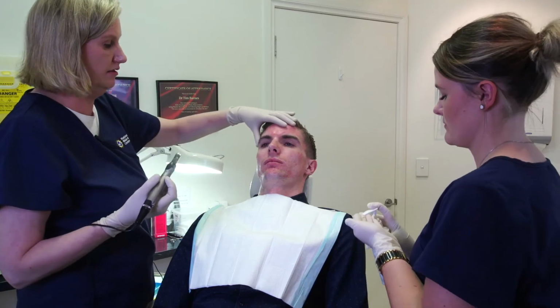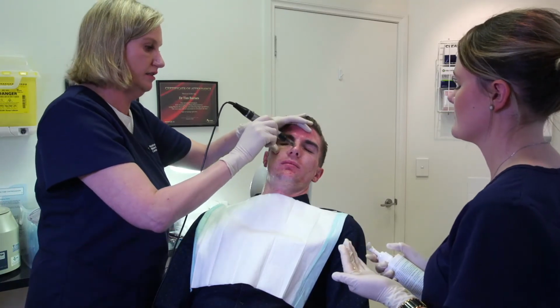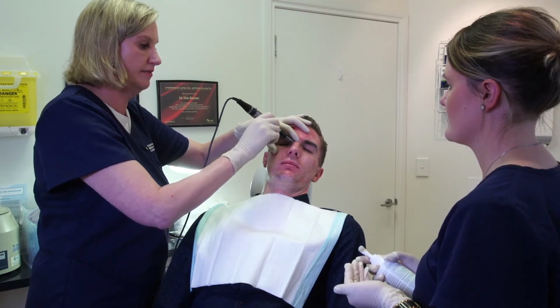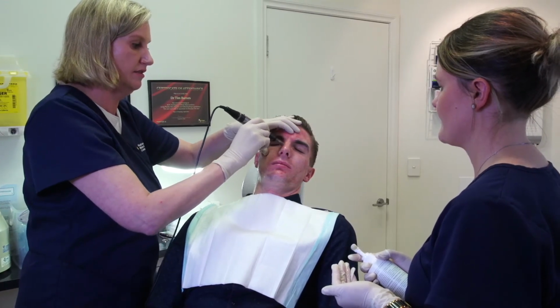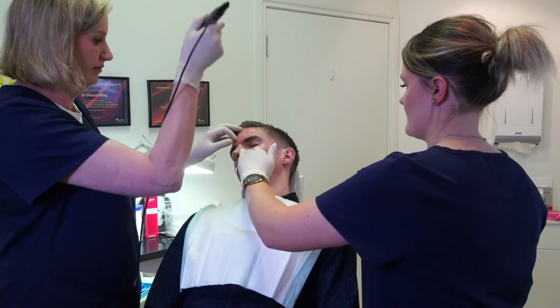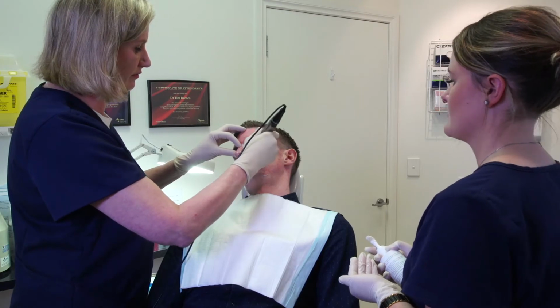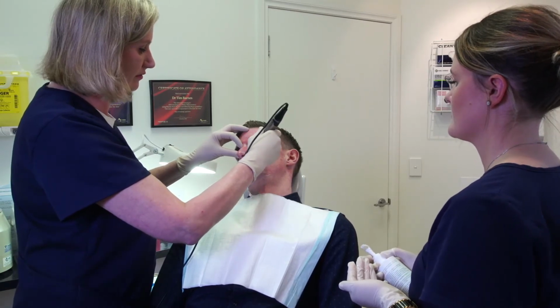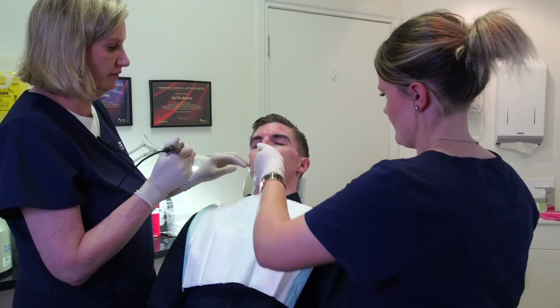Okay, we'll do the nose. So you can see how he's getting a nice rosy glow at the end of this treatment, which means it's had a good penetrative effect. And noses are good to do to help their pore minimisation. Okay, on the other side. Great, and I'll just get you to rear up with your upper lip, okay? Can we do the upper lip? That's great.